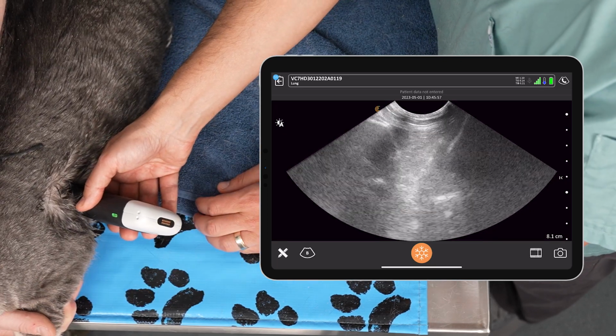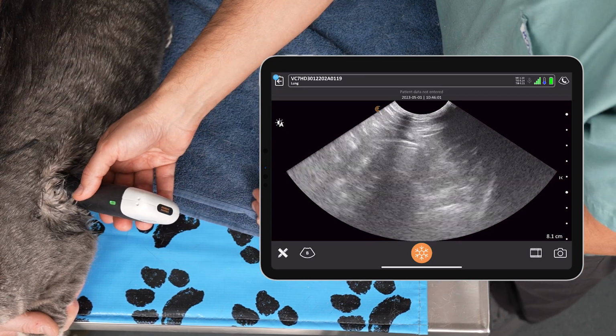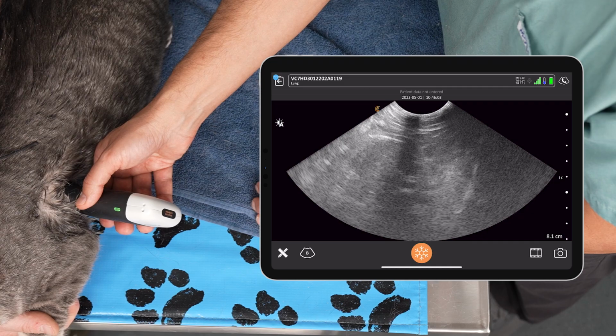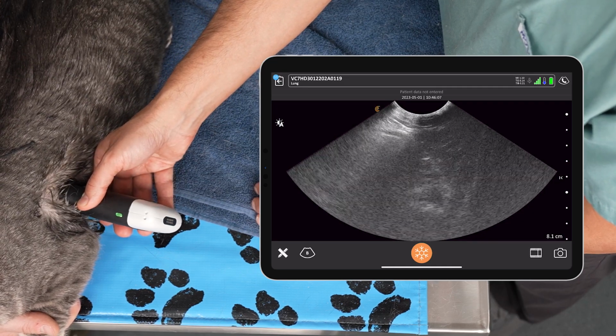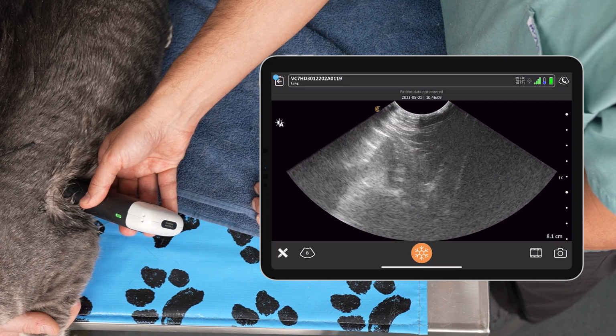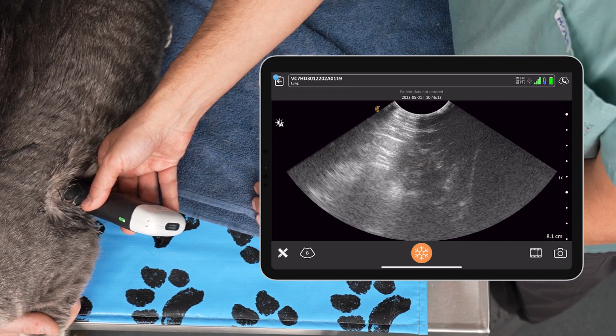That's right. And then what we do is we scan between the ribs, moving cranially up and down, looking for that alveolar interstitial disease. And there we go. And that is how we scan the lung for alveolar interstitial disease, looking for an increased number of B lines or lung consolidations. Absolutely. So we got one more other thing we'll look at. We covered it a bit here with that pleural effusion, but we'll look more specifically at how we identify pleural effusion in our next session.